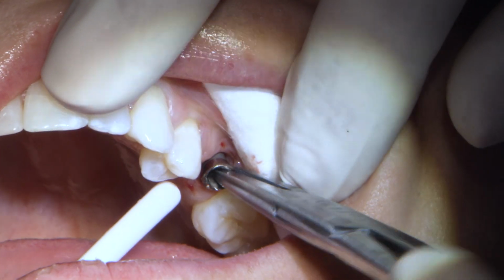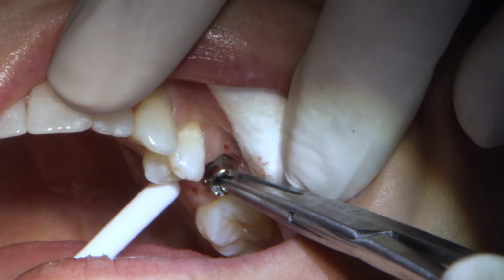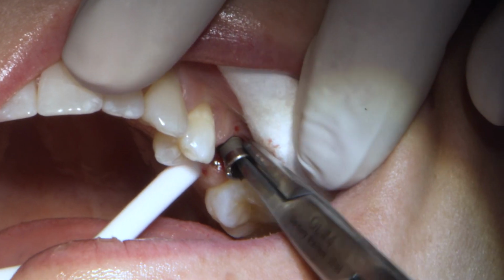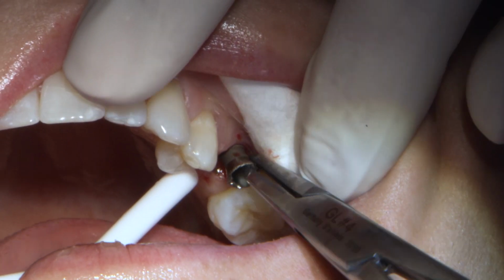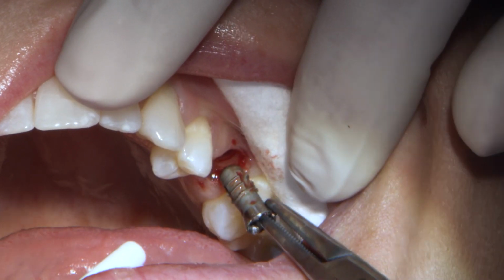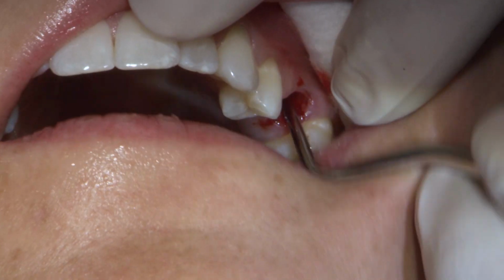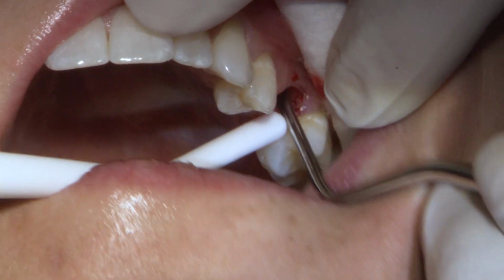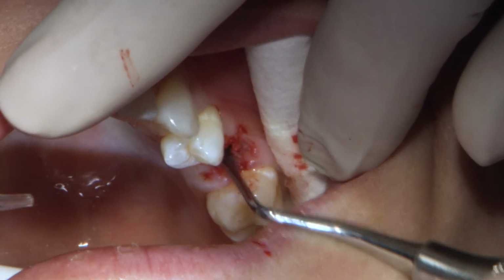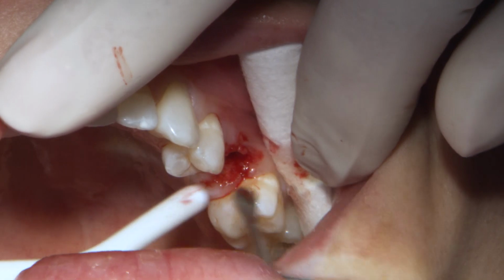Since the existing implant was moving in the bone, I was able to easily use a hemostat to help reverse the implant out. Once it was removed, we thoroughly rinsed and evaluated the site. This is what one of my mentors, Dr. Kurtz, refers to as a dry failure, meaning no visible infection, just a clean, dry site. On one hand, this is great because we are not worried about purulence or granulation tissue inside the osteotomy.